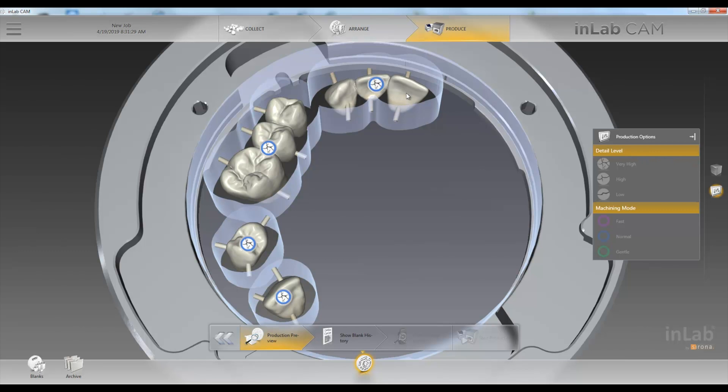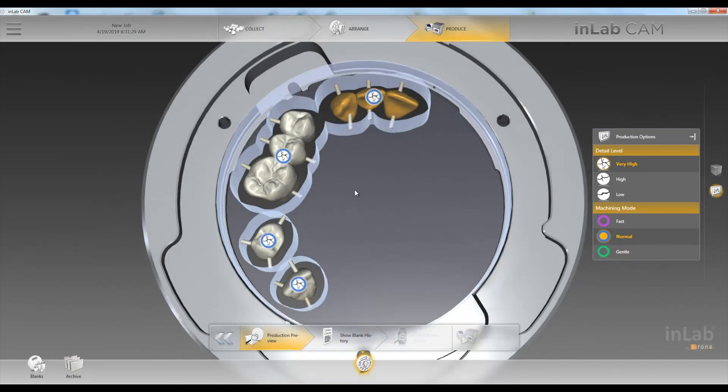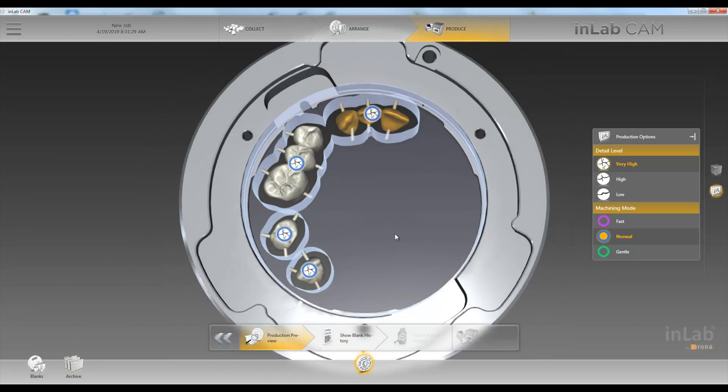Next we can choose our production options here. For most of our full contour we do very high and normal. Once we're happy we can go ahead and click Start Production. Thank you very much for joining us on this Tech in Two.